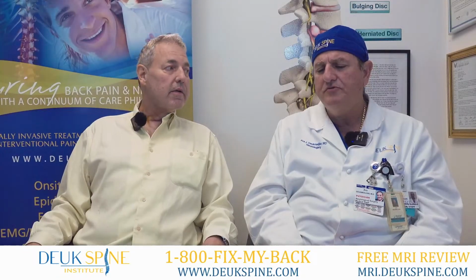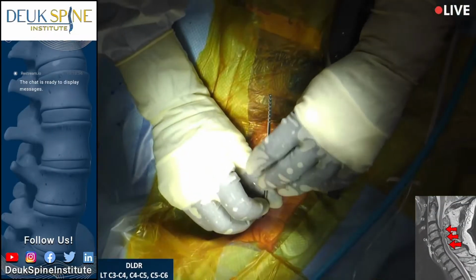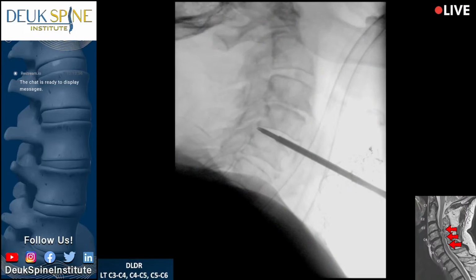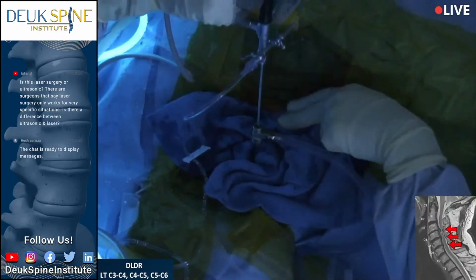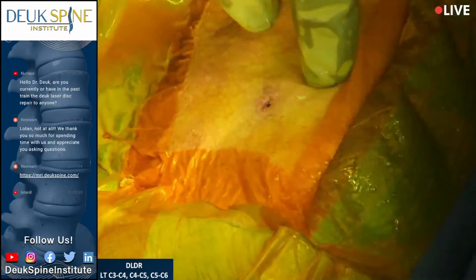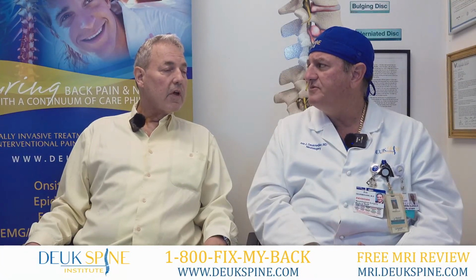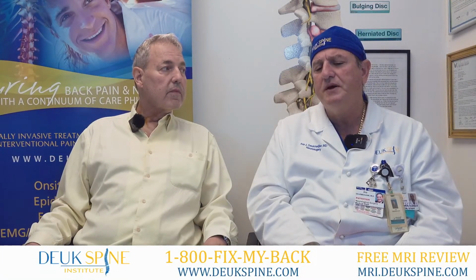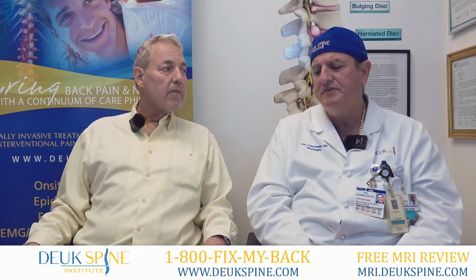And we did it all through a 4 millimeter incision. You could actually see the incision with the little tube going into your discs. I moved the tube from one disc to the next, and we went to the back of the disc where the tear was, and I cleaned the tears up with the laser. That usually does the trick of getting rid of the neck pain when it comes from a herniated disc. And of course, we unpinched the nerve roots that were going down your arm. So that's why your arm is feeling better as well.